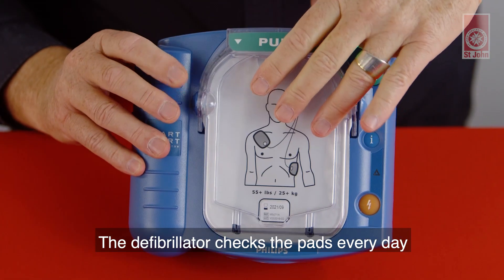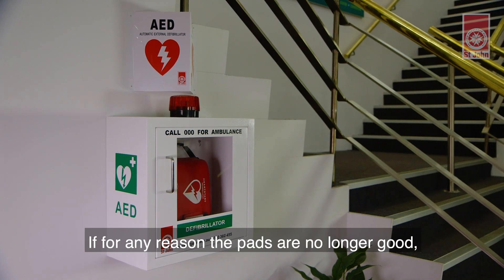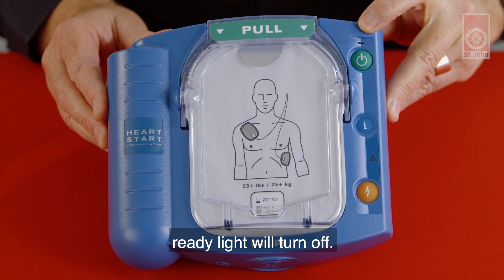The defibrillator checks the pads every day as part of its self-test. If for any reason the pads are no longer good, the defibrillator will start chirping and the green ready light will turn off.